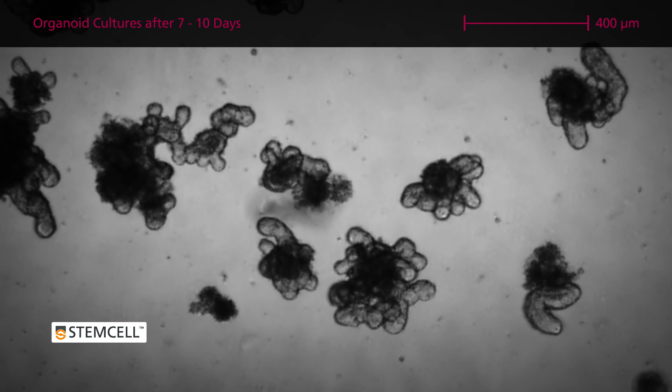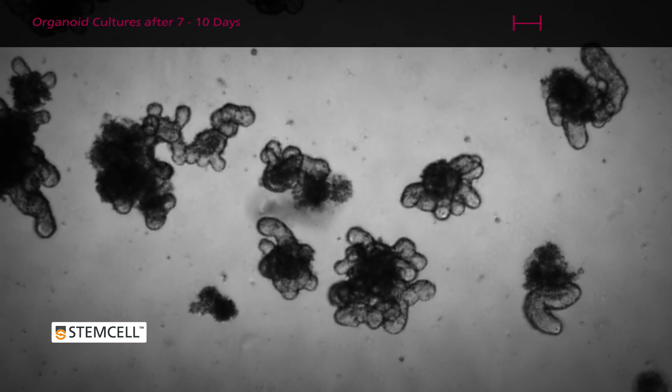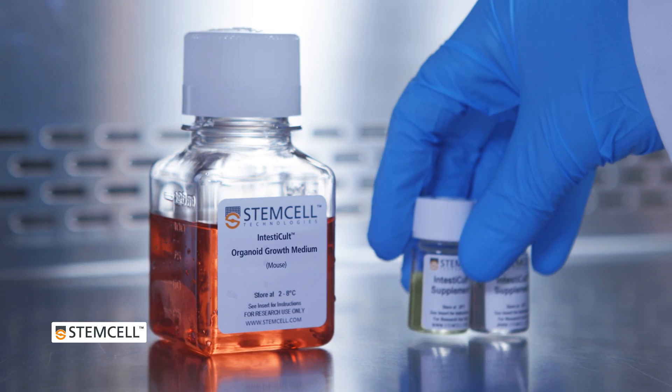After seven to ten days, the organoid cultures are fully mature and ready for passaging. Organoids will expand and exhibit crypt budding over the five to seven days following plating. Organoids should be passaged between days seven and ten post-plating to prevent overgrowth and excessive accumulation of debris within the lumen. For a detailed protocol for initiating intestinal organoid cultures using crypts isolated from mouse small intestine, watch the video Mouse Intestinal Organoid Culture with Intesticult Organoid Growth Medium.